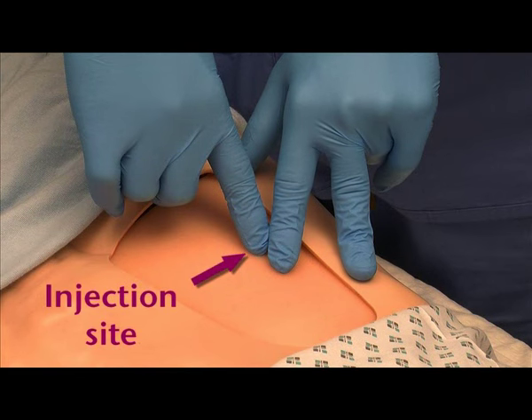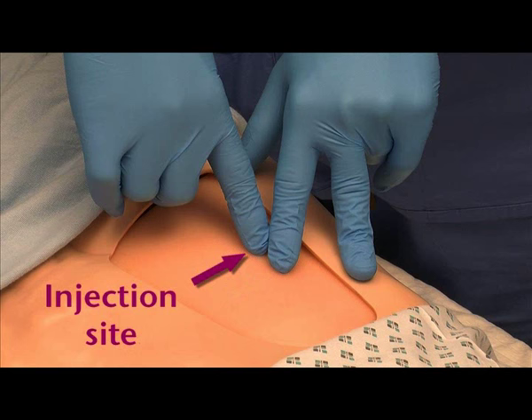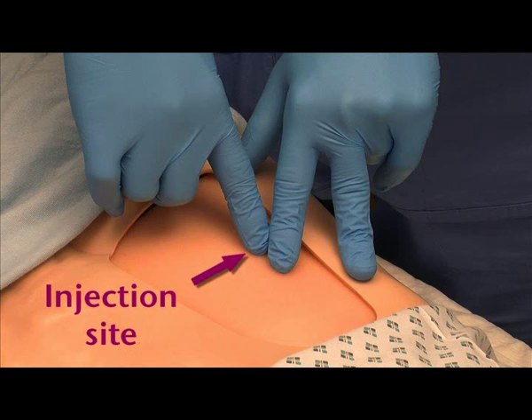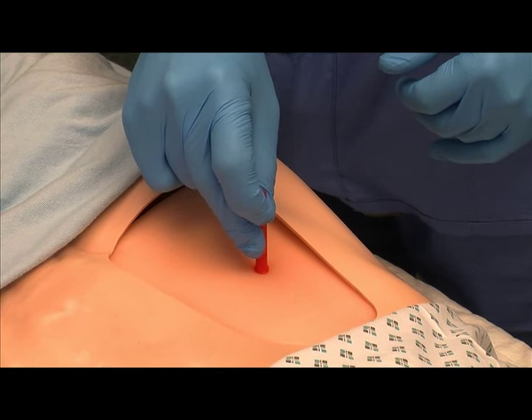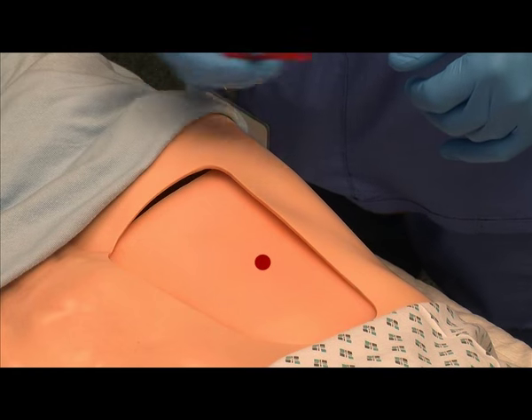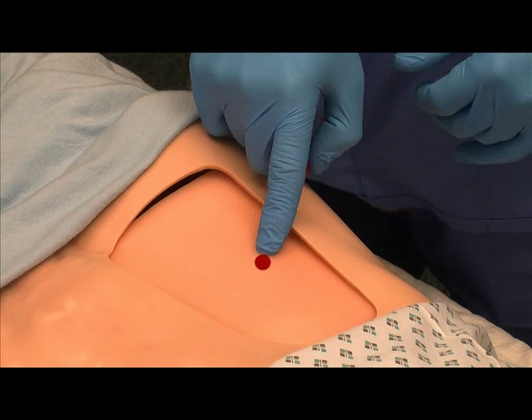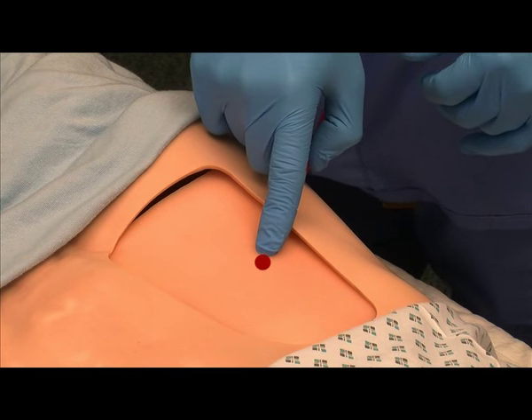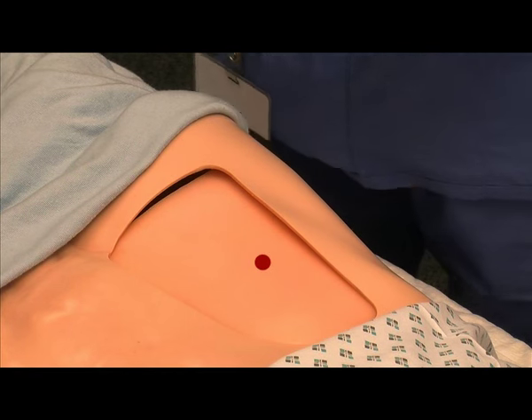Please note that the finger landmarks are reversed for a left hip fracture fascia iliaca compartment block. Once identified, the entry site can be marked with the reverse end of a needle cover. In this case, we have drawn on the landmarks to help illustrate the correct entry point.